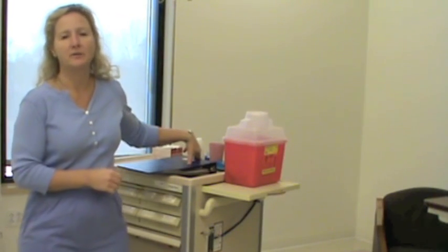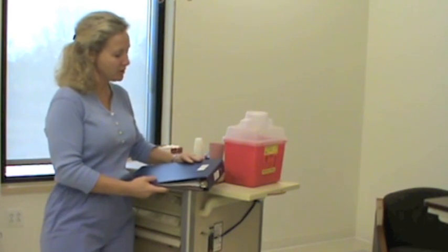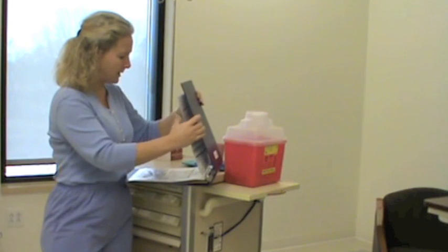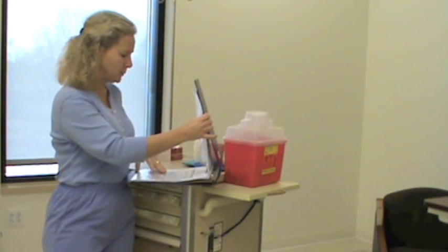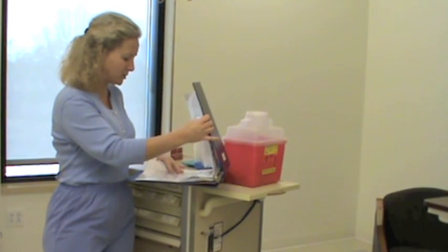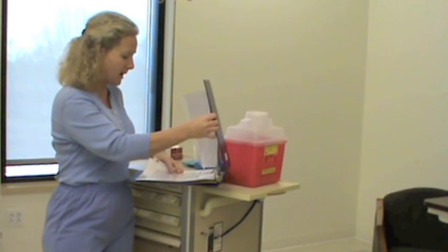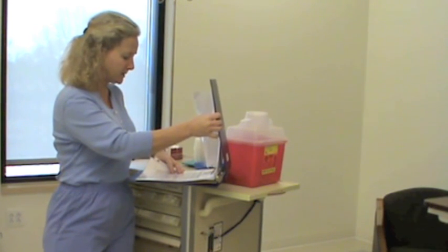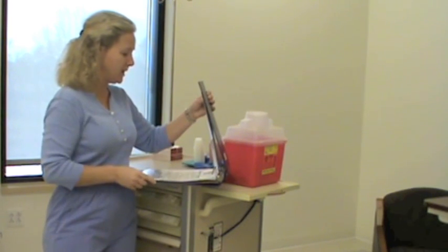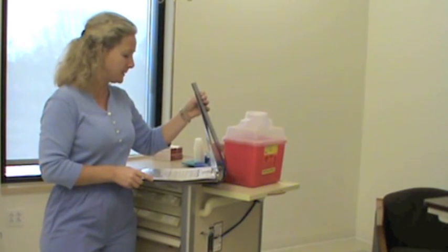Today we're going to be inserting a Foley catheter on Mrs. Morgan Brown. I'm going to check her chart and verify my order. Mrs. Brown came in with post-op sepsis and wound dehiscence, and we are going to be inserting a Foley catheter to continuous drainage and notifying the physician if the urine output is less than 30 mils per hour. I'm also going to be sending a urinalysis and culture and sensitivity. The reason we are doing the Foley insertion is because we need very accurate intake and output to watch her fluid balance because of the sepsis.